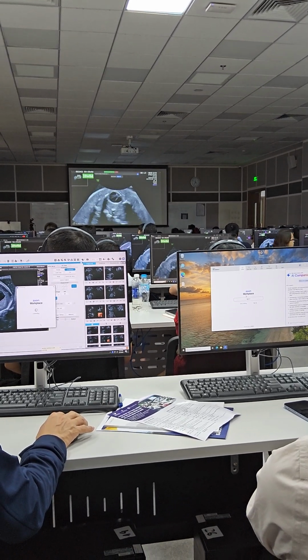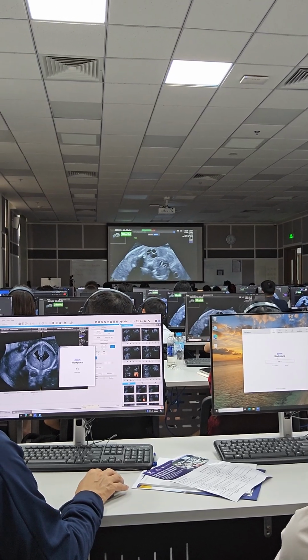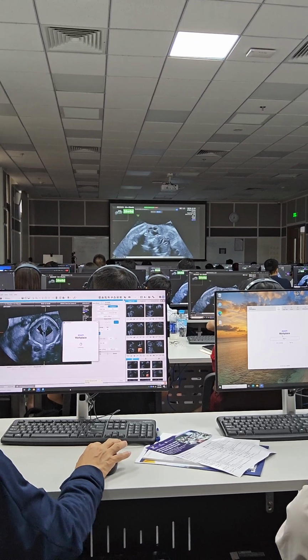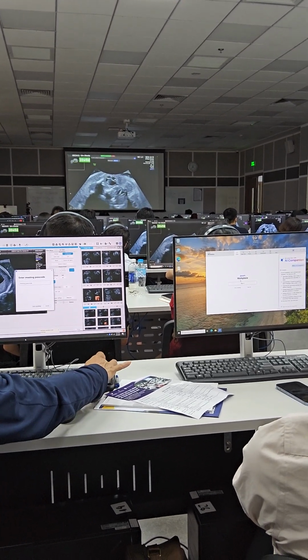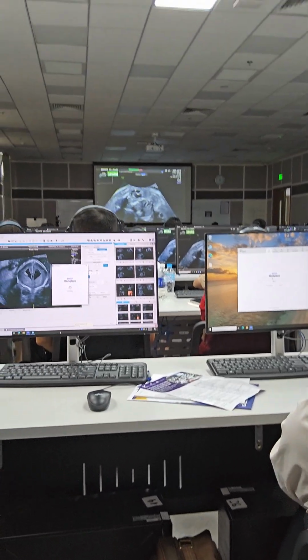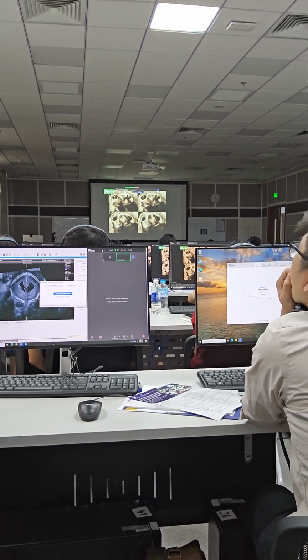So the eyeball, the eye movement is seen, but what is this? There are membranes here. What do you say about the membranes inside of the hyaloid artery, the eyeballs? Here you can see this one.